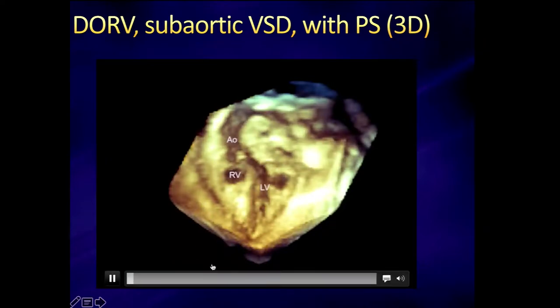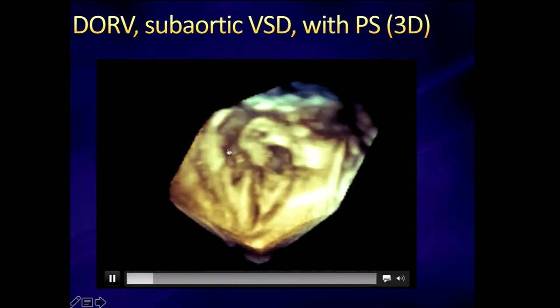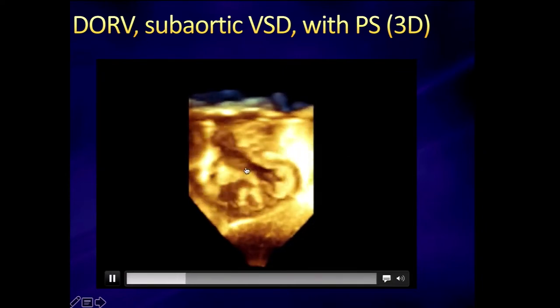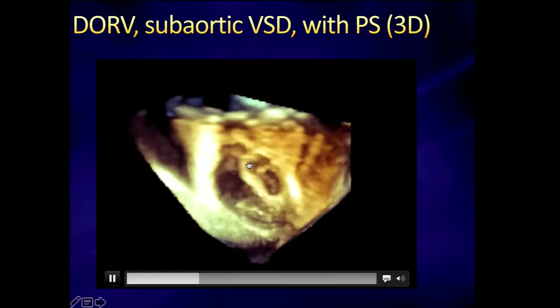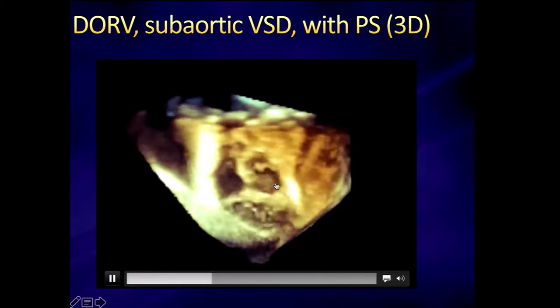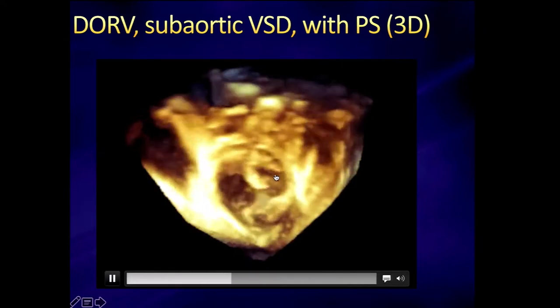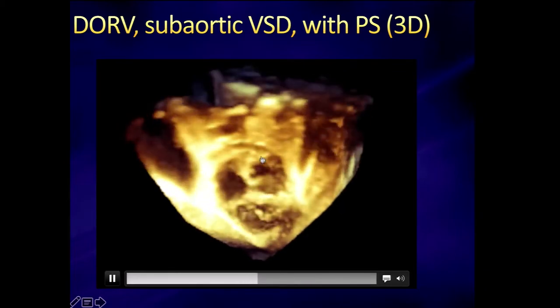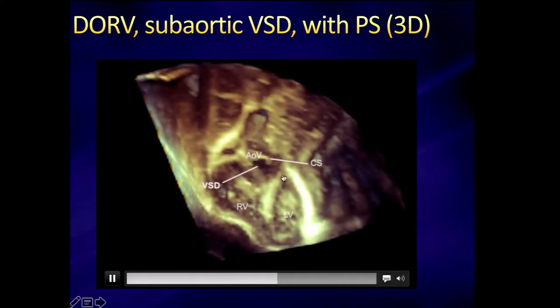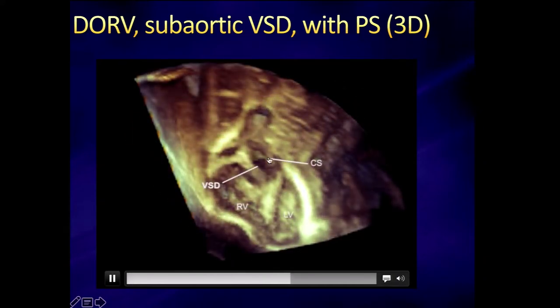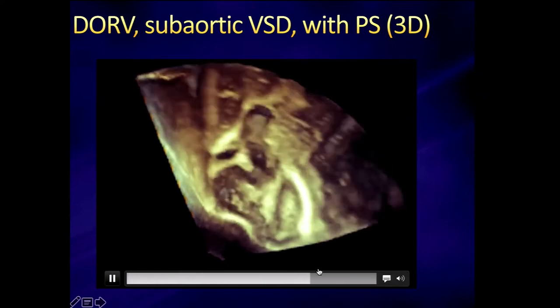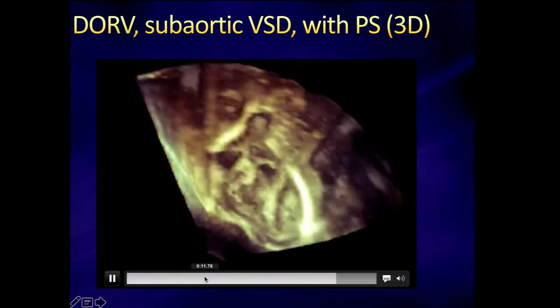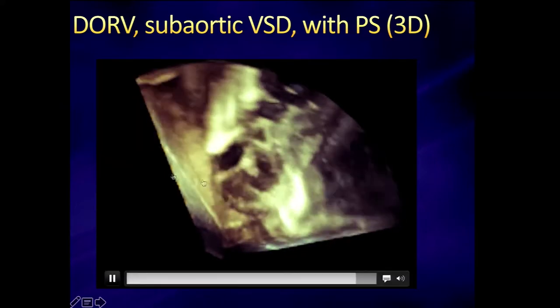On 3D echo, here's the LV, the RV, the aortic valve, and the VSD. As we change different views, you can see the discontinuity between the aortic valve and the mitral valve. As we sweep more anteriorly, there's the pulmonary valve with significant subpulmonary stenosis — a hypoplastic infundibulum. You can see the conal septum and how narrow it is. This is a very useful look because it kind of looks like a pathologic specimen, but it's in motion — it's 4D motion, which is quite nice.